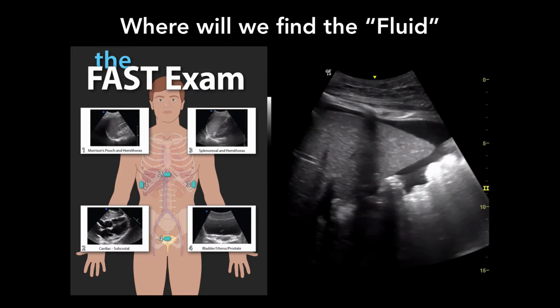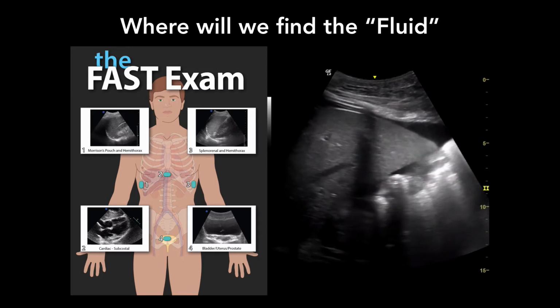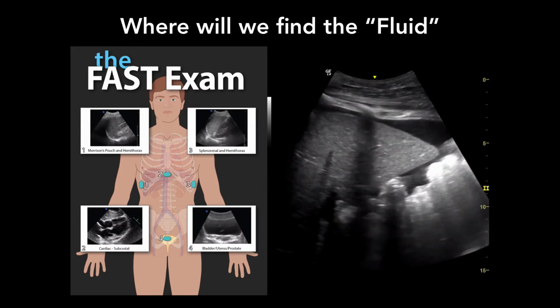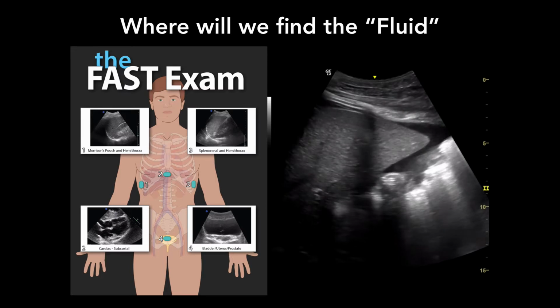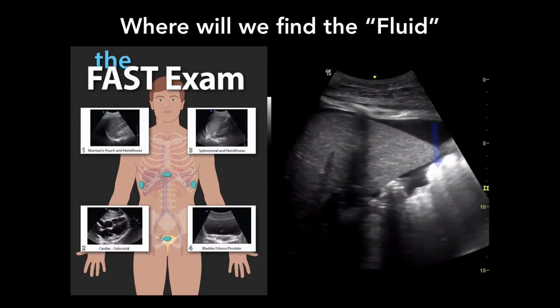Here's another one. Look how much more fluid this is. Is this a lot of fluid? Yeah, it's a lot of fluid, but is that important or not? Well, if that was ascites, that might not actually be a lot of fluid for ascites, right? Ascites can be liters of fluid. But if that was blood, would that be a lot of fluid? That'd be a real lot of fluid, right? So you have to put it in clinical context to know what things are.